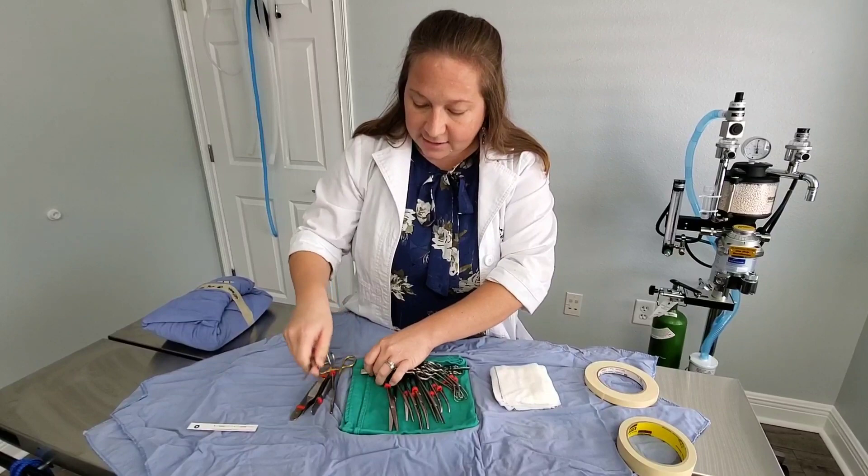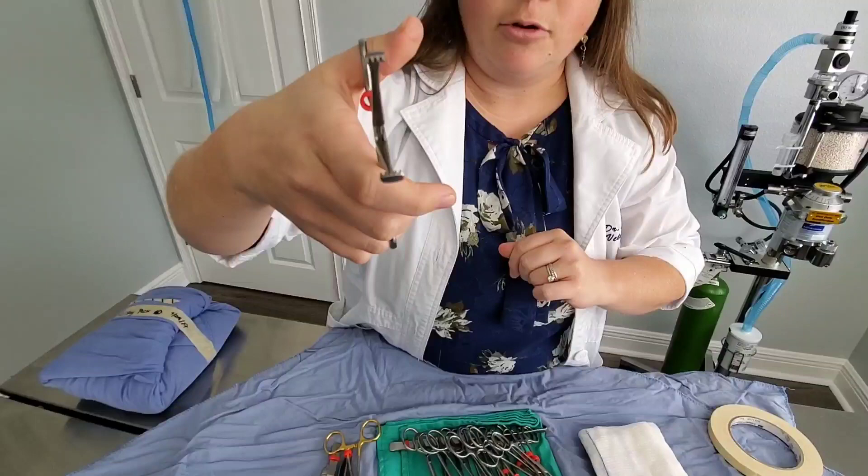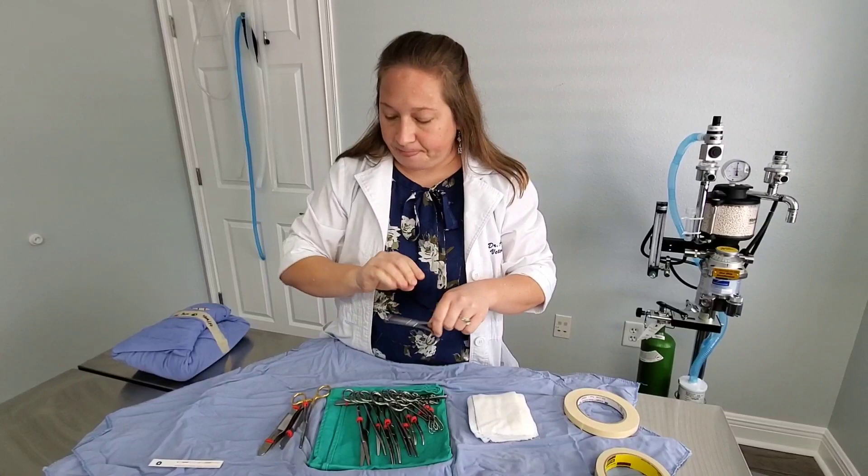These are called the Allis tissue forceps. These are good for grabbing onto different kinds of tissues, especially tissues that are going to be removed from the body. You can see the little tiny teeth on there — those can be traumatic to tissues too, so we have to be careful about which tissues we use these on.